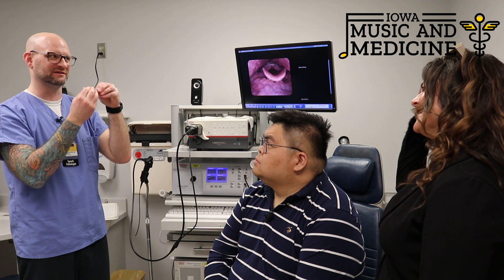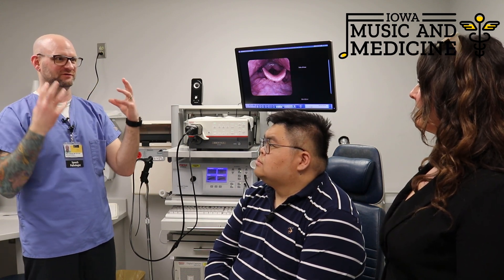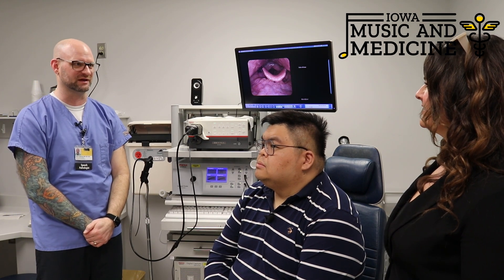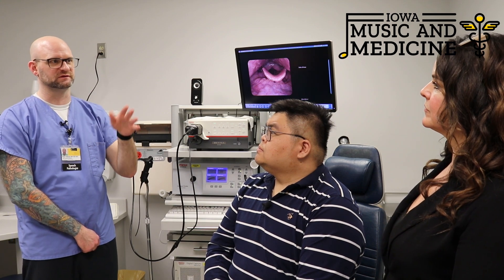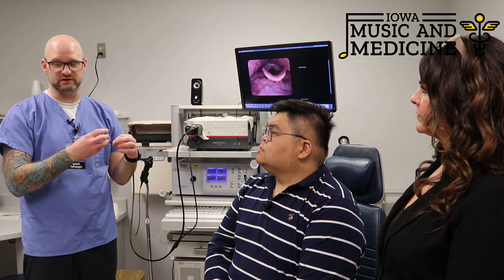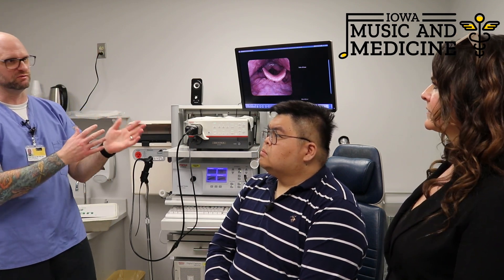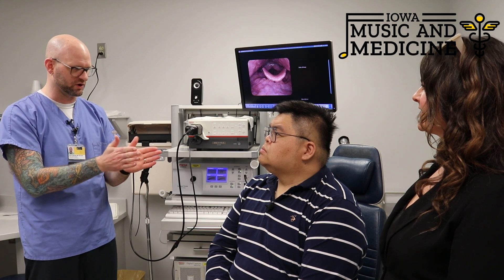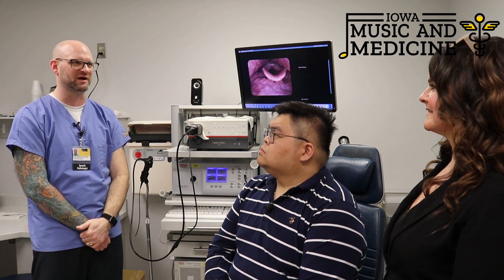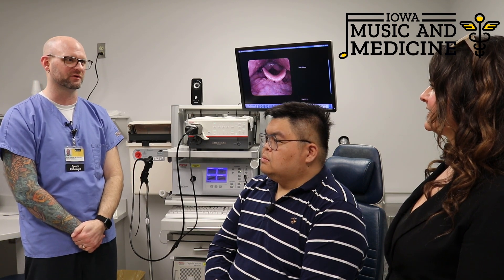This may be related to formants — he's optimized the arrangement of everything in the vocal tract to hit all of those formants and really get them as lined up as possible to get that full projected sound. We weren't using the stroboscopy when he was singing, just to not add that extra buzz sound to the feed. But definitely when we were having him do the sustained tones before, that microphone on the neck was coordinating the flashing light with how fast the vocal folds were vibrating, so we could see that fine vibration and viability of the vocal folds.